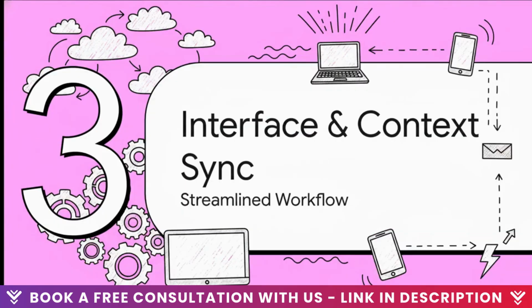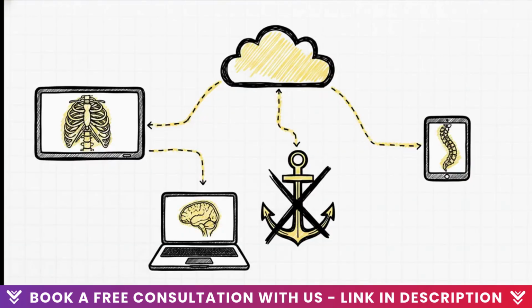Section 3. Interface and context sync. Next up, we need to frame the interface. It is absolutely crucial that we move away from those heavy, localized installations to a streamlined, highly accessible workflow. Look, radiologists today are working from hospital reading rooms, home offices, satellite clinics, you name it. Because of that, you desperately need a zero-footprint web viewer like the open-source OHIF viewer.